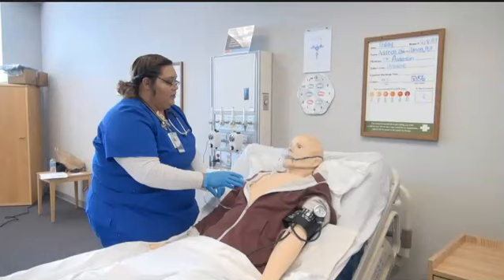Please note that if the patient's heart rate increases more than 30 beats per minute, the treatment should be stopped. Also note that if the patient's respiratory rate increases above 22 breaths per minute, the therapy should be stopped. It is important to continue to monitor your patient during the treatment. This is what she will be doing, including encouraging the patient to take a deep breath every 5 or 6 breaths until the treatment has been complete.